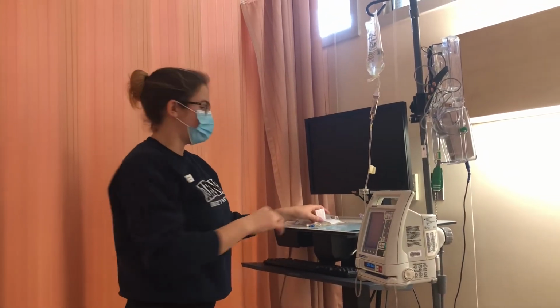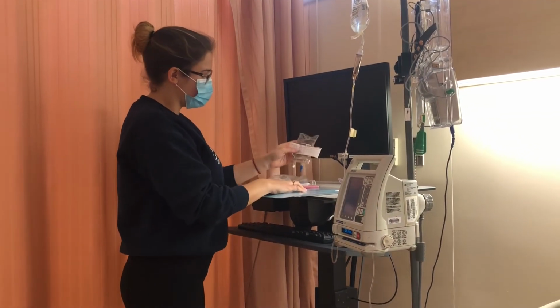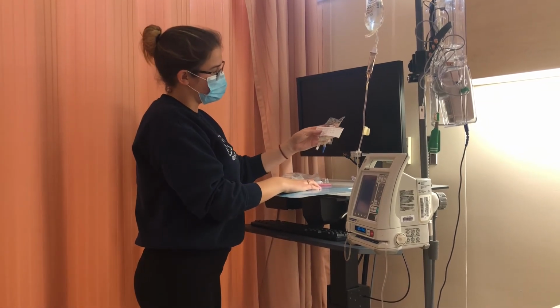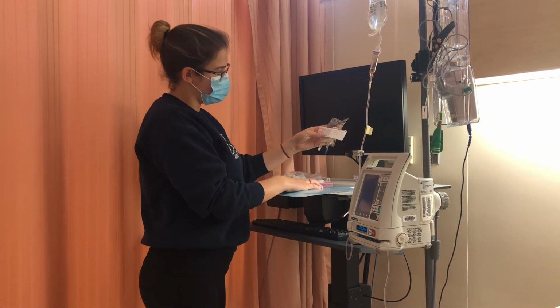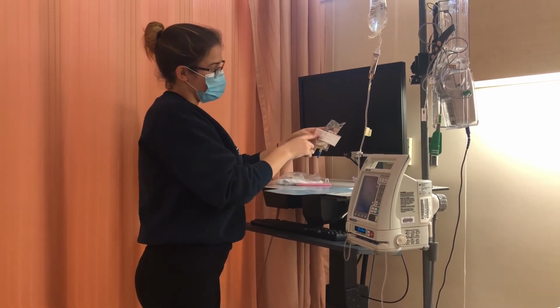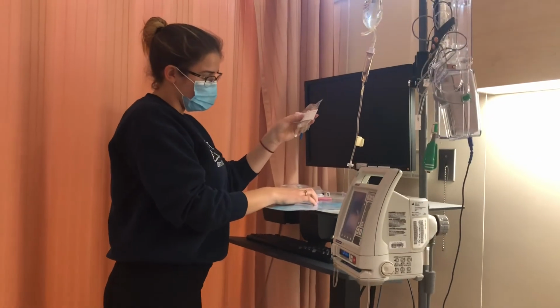So I'm going to do my third med check. So I have Emma Wrightson. My drug is cloxacillin. The dose is 750 milligrams. 750 milligrams on here because I had 250 milligrams per ml, and I reconstituted with, and I drew up 3 ml to get the 750 milligram dose, so that's right. It's an IV drug, it says on the MAR, and this is IV.